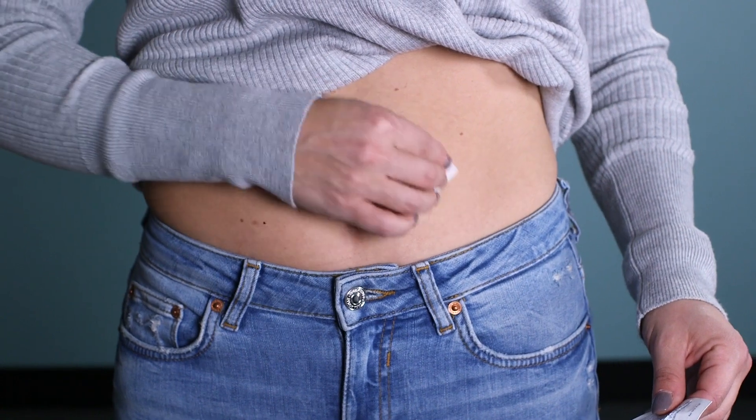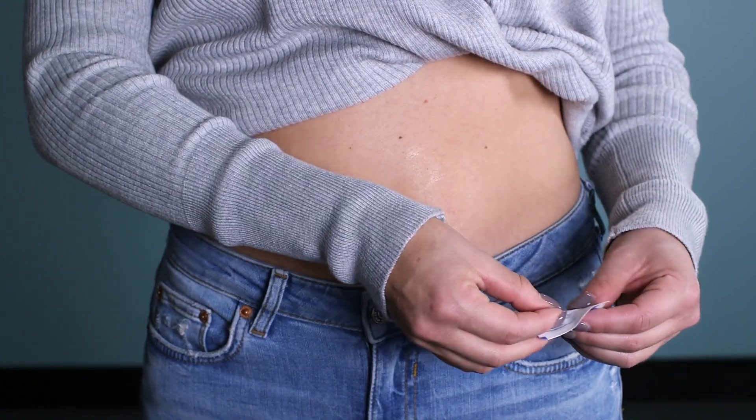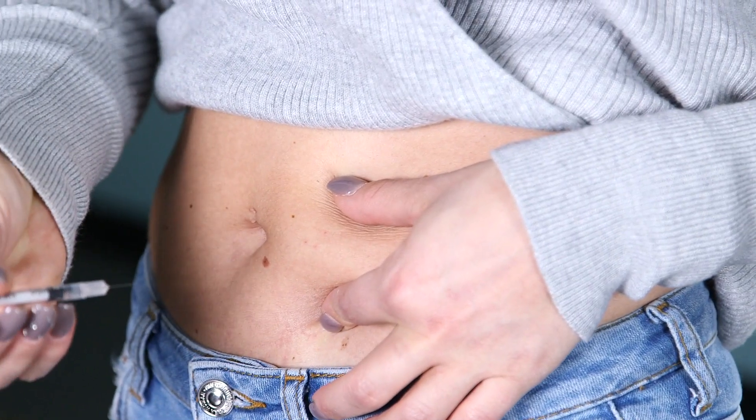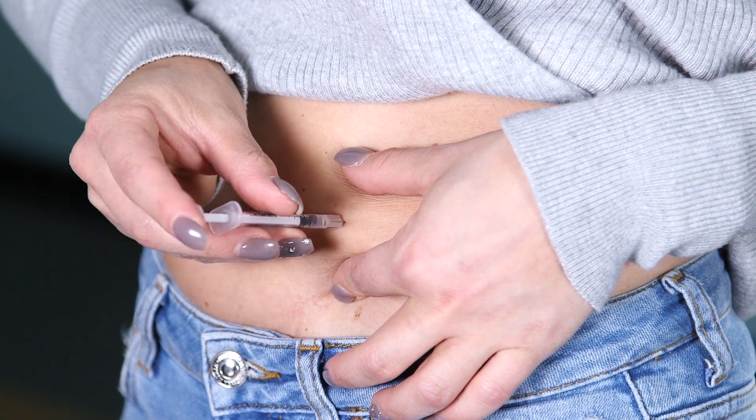Alcohol wipe the skin on the abdomen where you're going to receive the injection. Let the alcohol dry. Hold the syringe like a dart. Squeeze the skin. The needle goes straight in at a 45 to 90 degree angle.